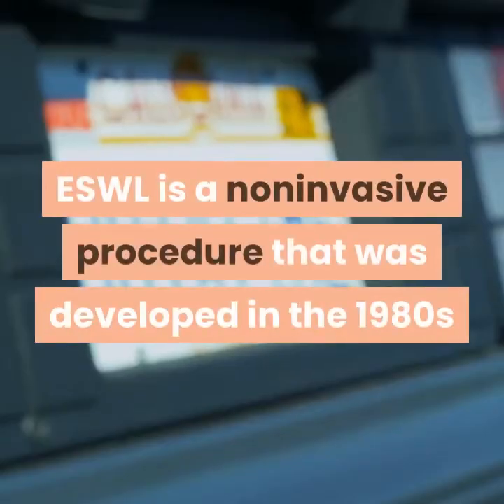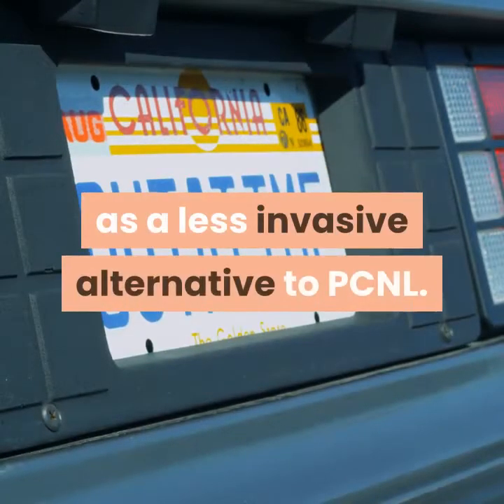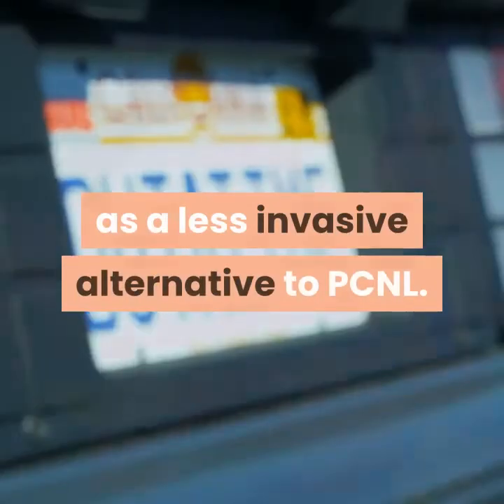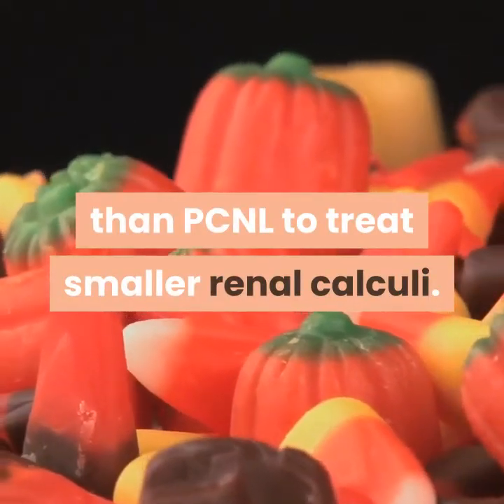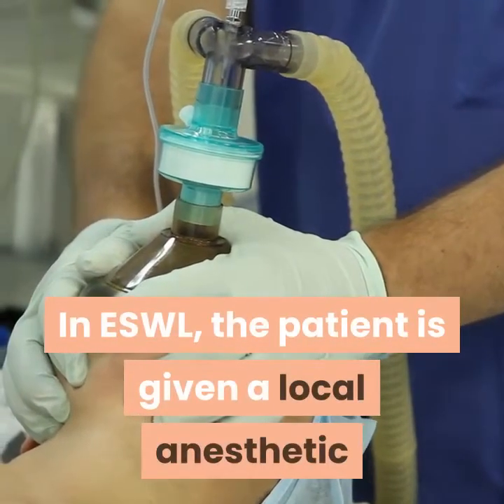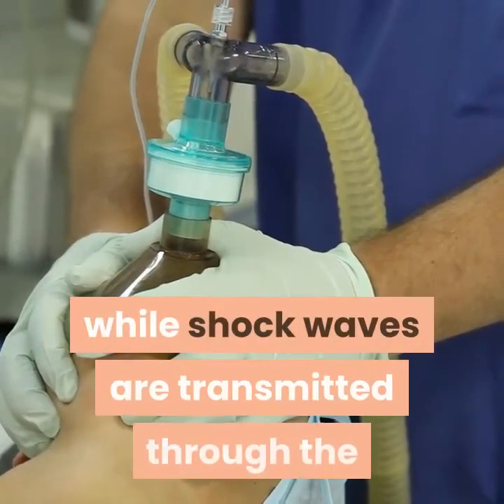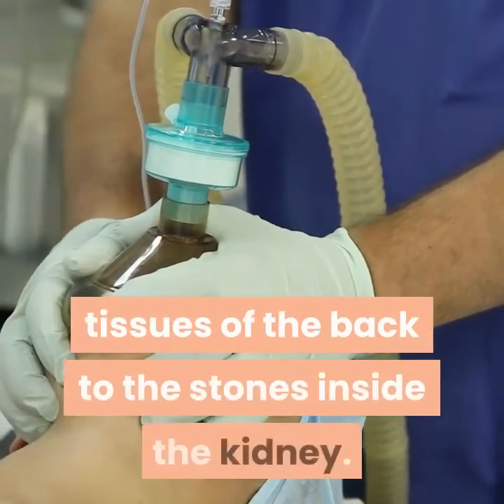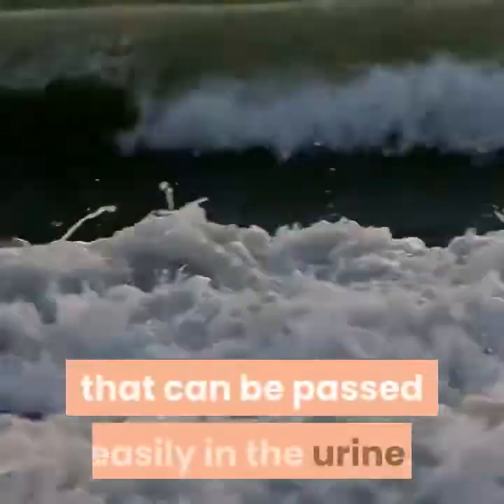ESWL is a non-invasive procedure that was developed in the 1980s as a less invasive alternative to PCNL. It is presently used more often than PCNL to treat smaller renal calculi. In ESWL, the patient is given a local anesthetic and placed in a water bath or on a soft cushion while shock waves are transmitted through the tissues of the back to the stones inside the kidney. The shock waves cause the calculi to break up into smaller pieces that can be passed easily in the urine.